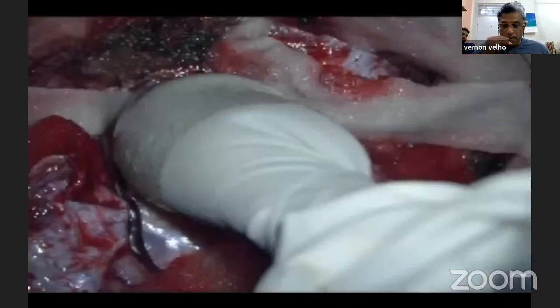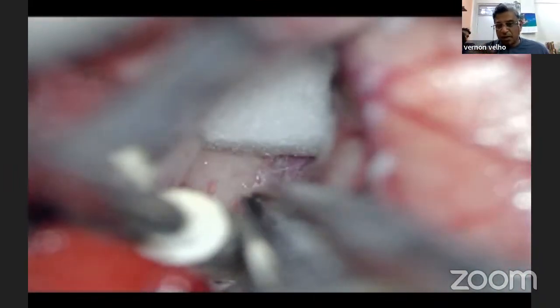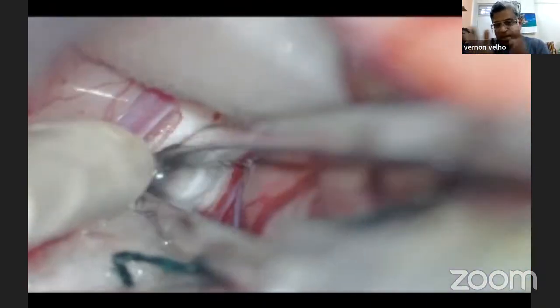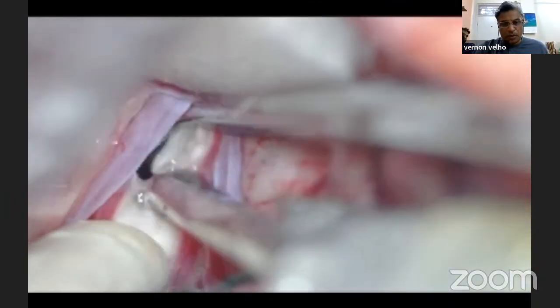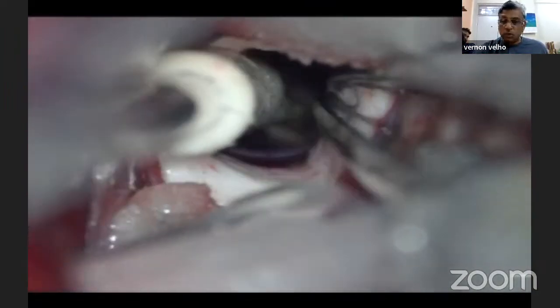So the important thing is to go anterior to the coronal suture first, because that's the area where you will have less veins. Here what we are doing is we are putting Merocel. We can put 2 blocks of Merocel anteriorly and posteriorly to keep the hemisphere retracted. So you get space to work between the pericallosal, a small opening into the corpus callosum, and then one can enter. Sometimes the colloid cyst pushes the foramen of Monro towards you.